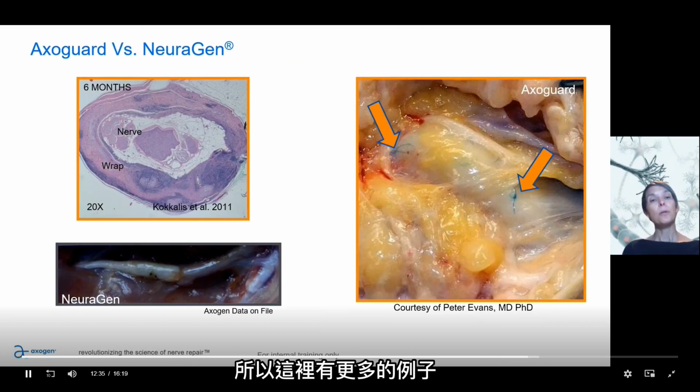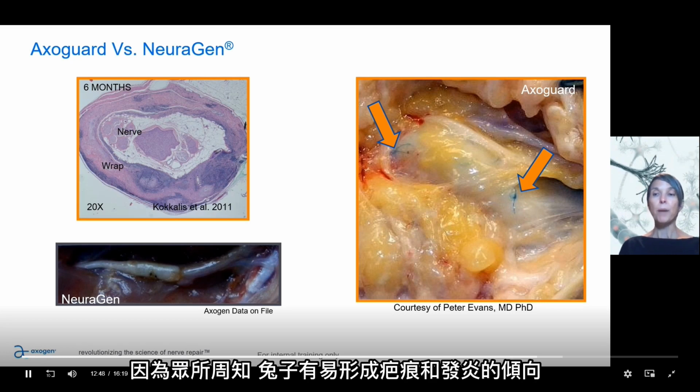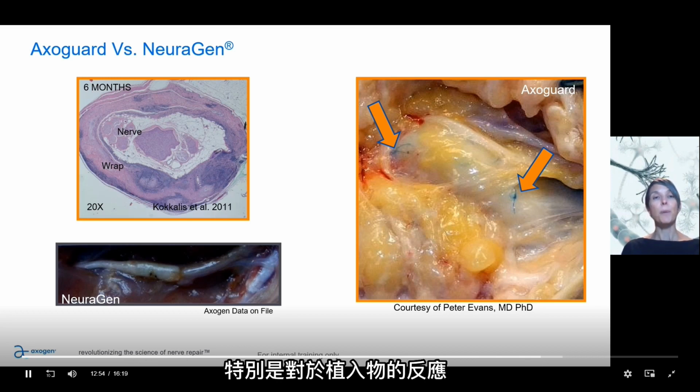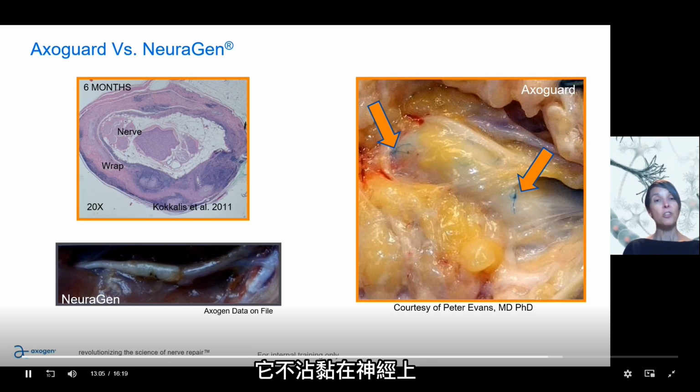So here are just some more examples of what these things look like. The top picture on the left is from the initial animal study that we did looking at the Axoguard material around nerve. It was done in a rabbit model because rabbits are known to have a propensity for scarring and inflammation, especially in response to implants. And what we found was that at 6 months, the material had remodeled into this nice new tissue layer around the nerve. It didn't adhere to the nerve at all, and the nerve was able to freely glide within that material. The picture on the right is what this looks like in surgery.